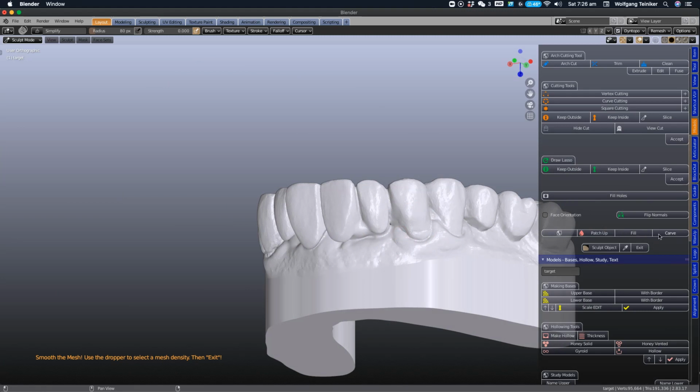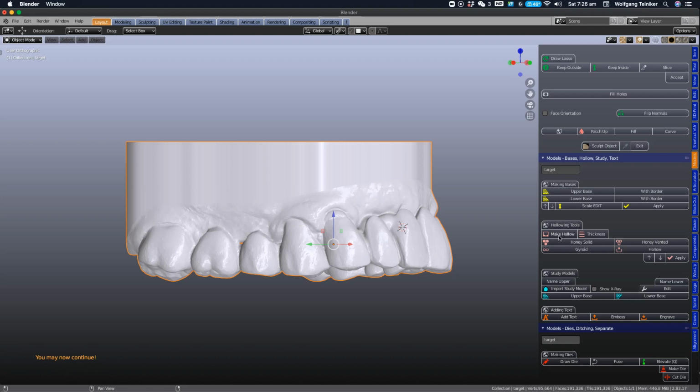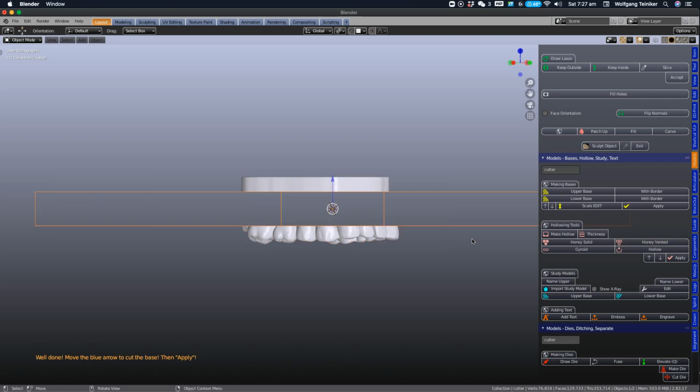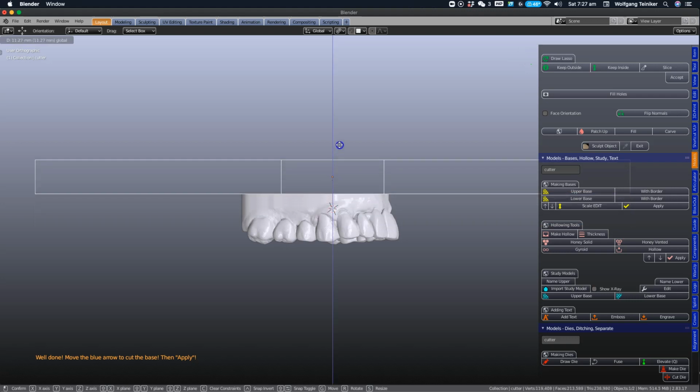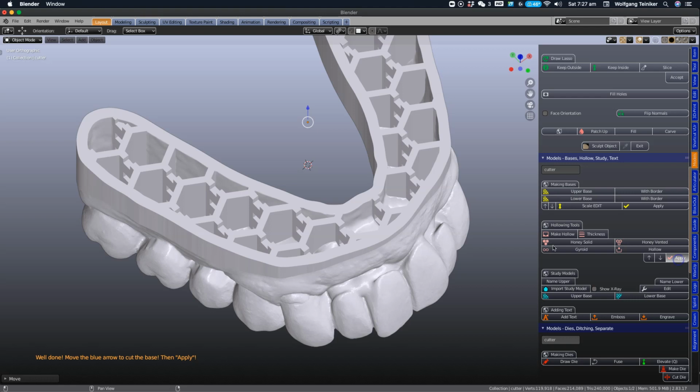Excellent. Lastly, I'm just going to hollow this. So we're going to exit out of the smoothing. Turn it upside down. I like working this way. Just going to use the make hollow. And I like using the honeycomb vented. And just pulling this tool upwards like that. Here we go, nice and neat, and push apply.